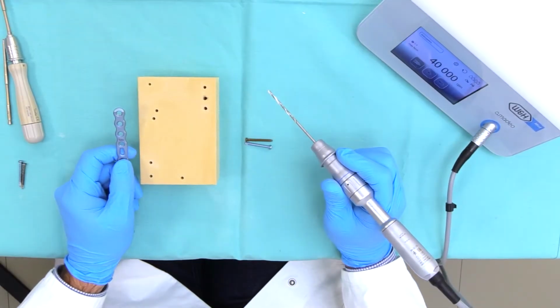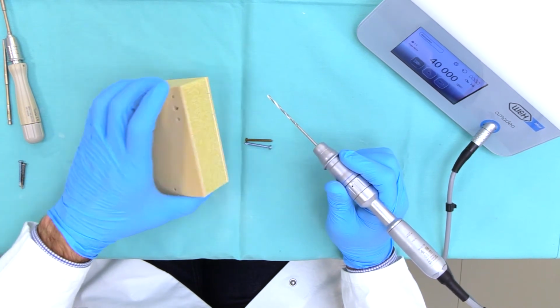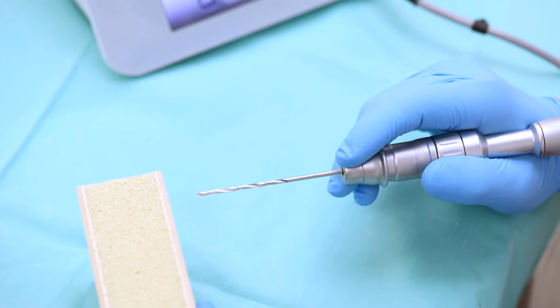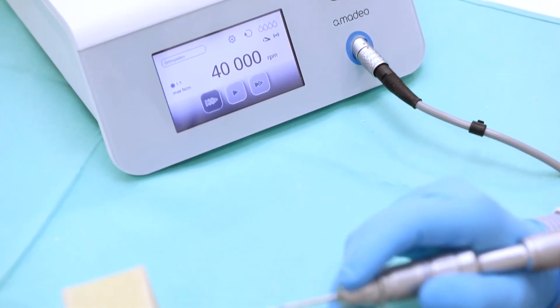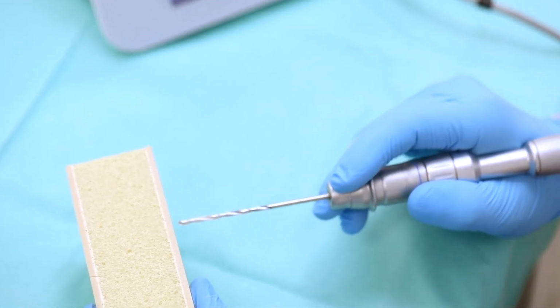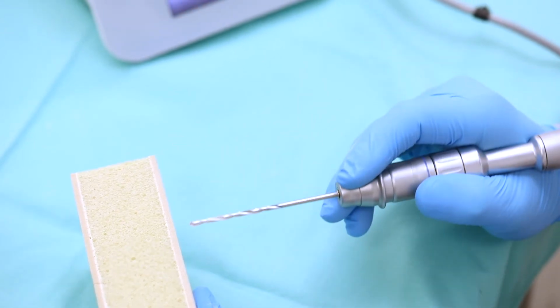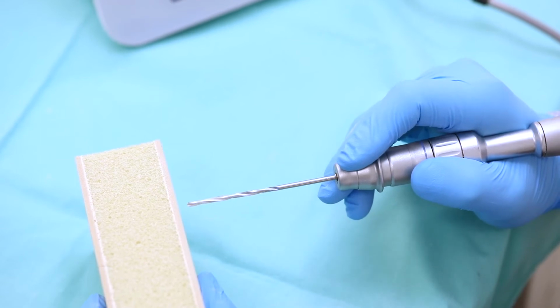One of the advantages of angular stable screws is in osteoporotic bone. This is a model of an osteoporotic bone. For drilling, we use 40,000 rounds per minute. To avoid heat necrosis, you should not press too much on the bone and always use sharp drillers. I control it with the foot control.